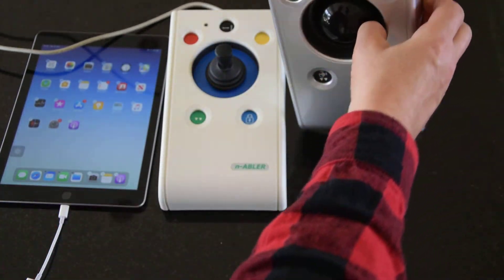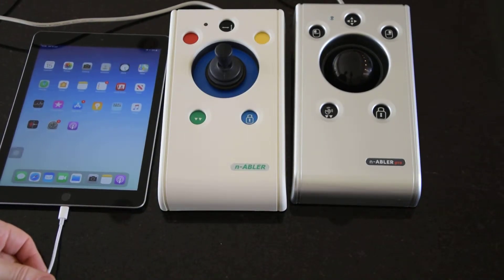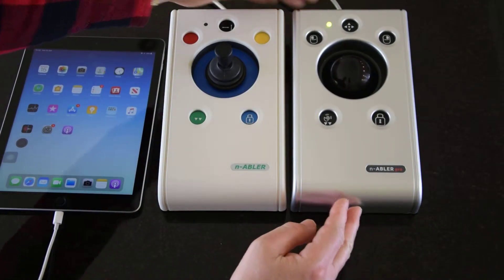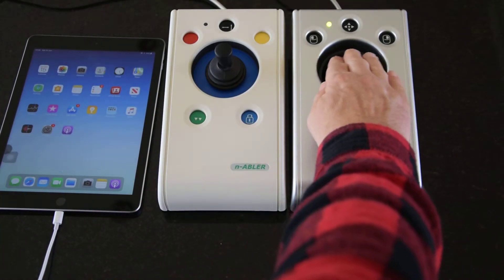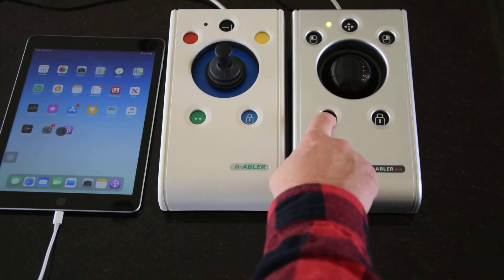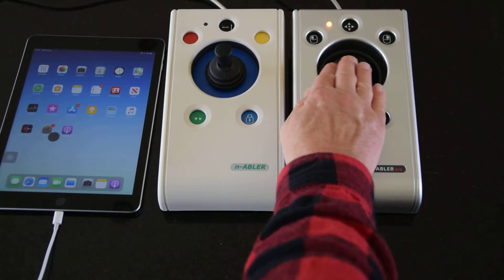The Enabler Pro is exactly the same in those respects. Plugging in the Enabler Pro — this is the trackball version, but otherwise largely the same. The additional feature it has is anti-tremor, which is particularly applicable to a trackball, because with a tremor it becomes almost impossible to get over an app and click on it in time. Press and hold, double tap, and the LED turns orange to indicate the feature is on — and to a large extent that tremor has gone.